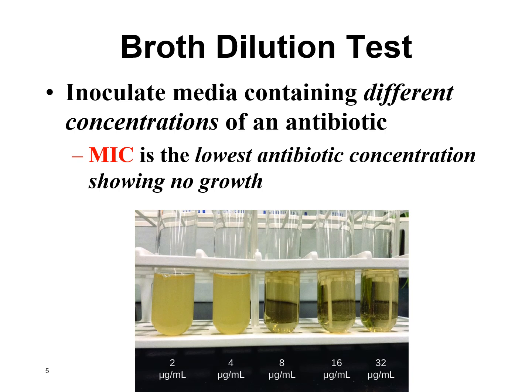So on your lab report, they say penicillin, and they say the MIC is 8 micrograms per mil. And then they'd have a way in the lab where they could tell you if that would be susceptible, intermediate, or resistant, depending on what levels you would reach in the body, depending on the doses that are given. As long as you can reach above that 8 micrograms per mil at the site of the infection, then penicillin would work and would get rid of the infection.